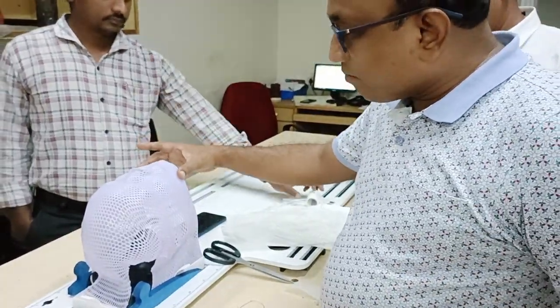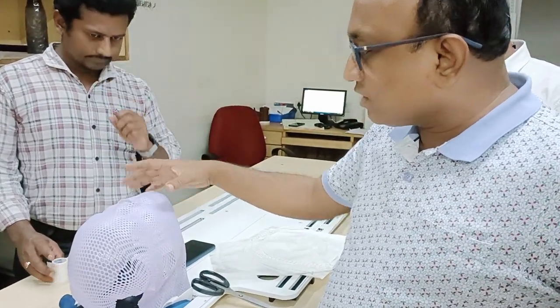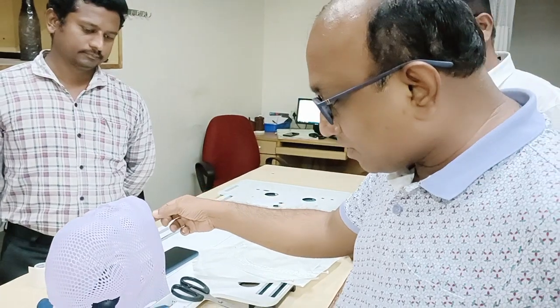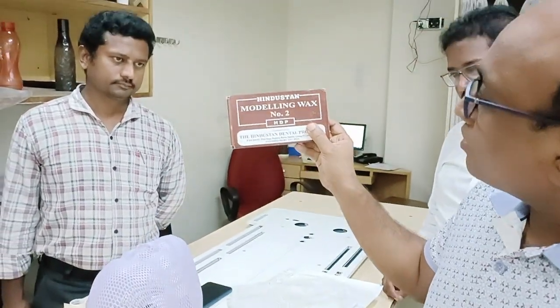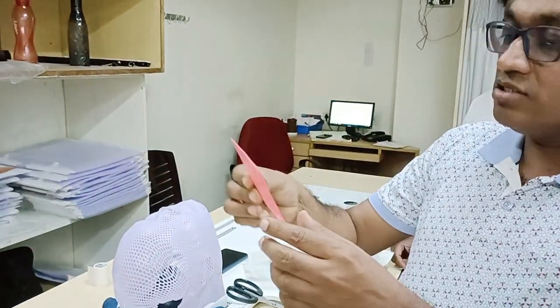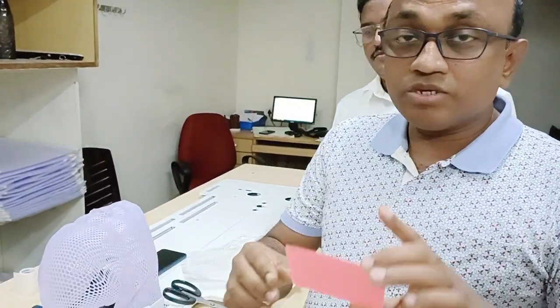Suppose there is a cancer in the cheek — you make a mask of the head and neck. After making the mask, you use modeling wax. This is called Hindustan modeling wax, which comes in elongated sheets.